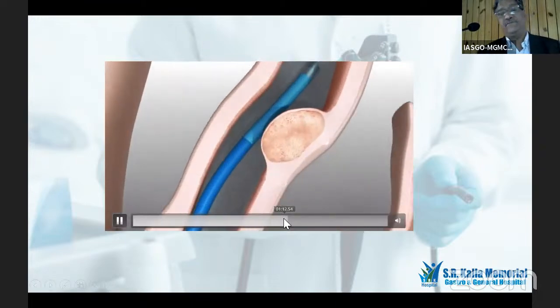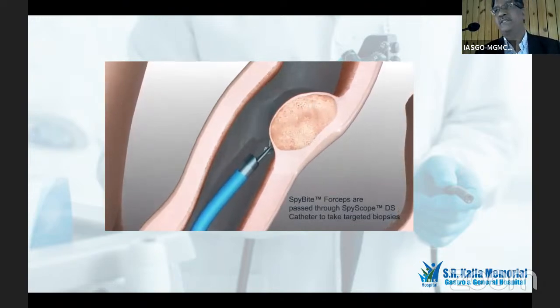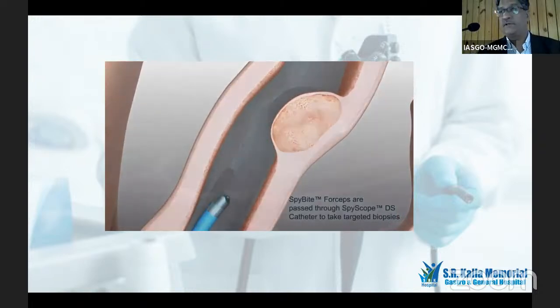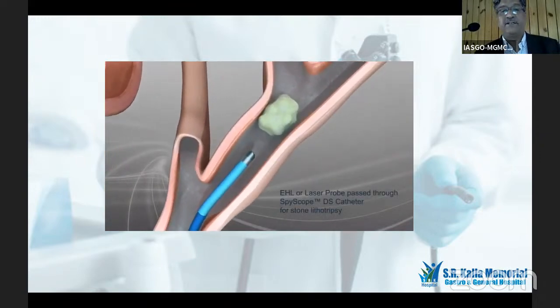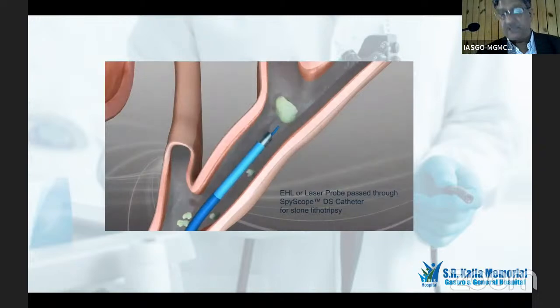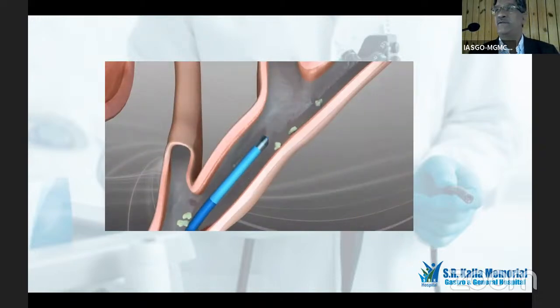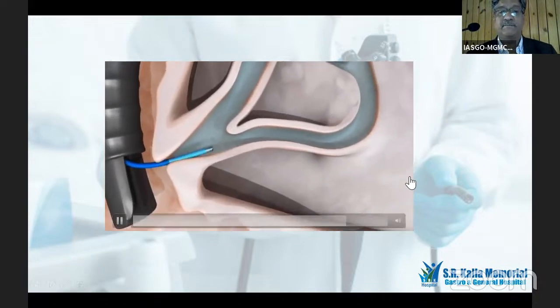So if at all the hepatobiliary anatomy permits, now probably with the advent of this particular technology, we can say that CBD exploration should be thought of later and this particular option should be given priority. So this is how a laser lithotripsy is done. There is a fiber which comes through the scope. It just fragments the stones. And that is how a 30 to 40 minute procedure, which is quite cost effective, is a daycare procedure. Patient goes home the same day evening.